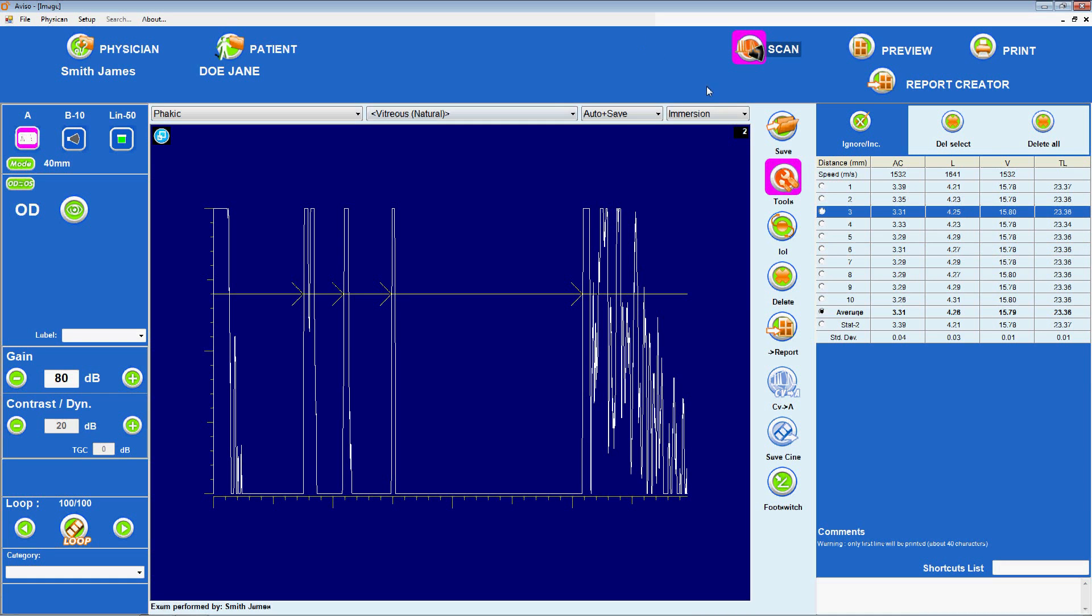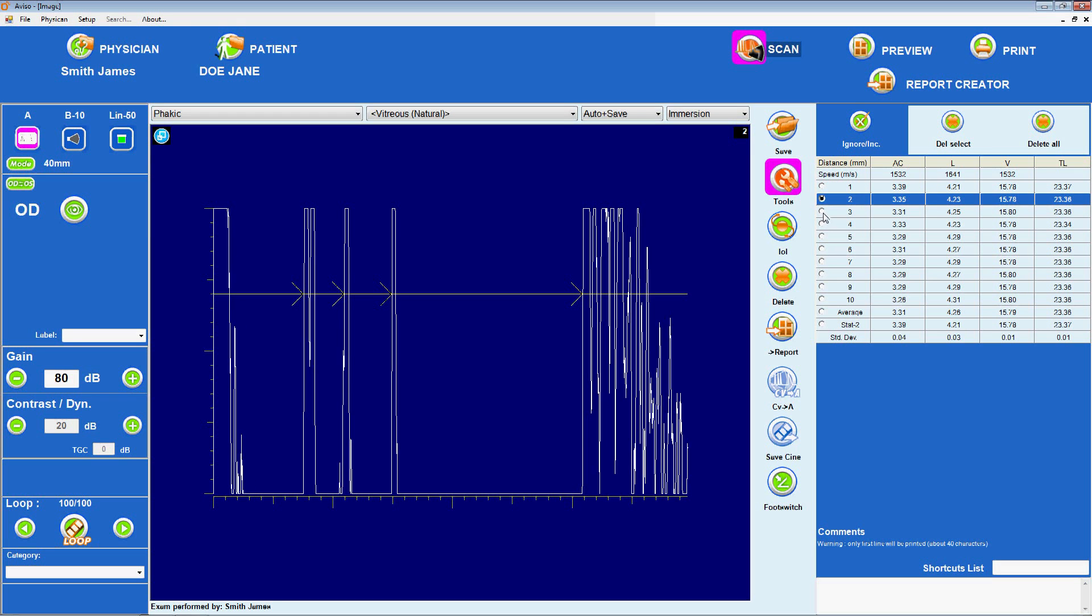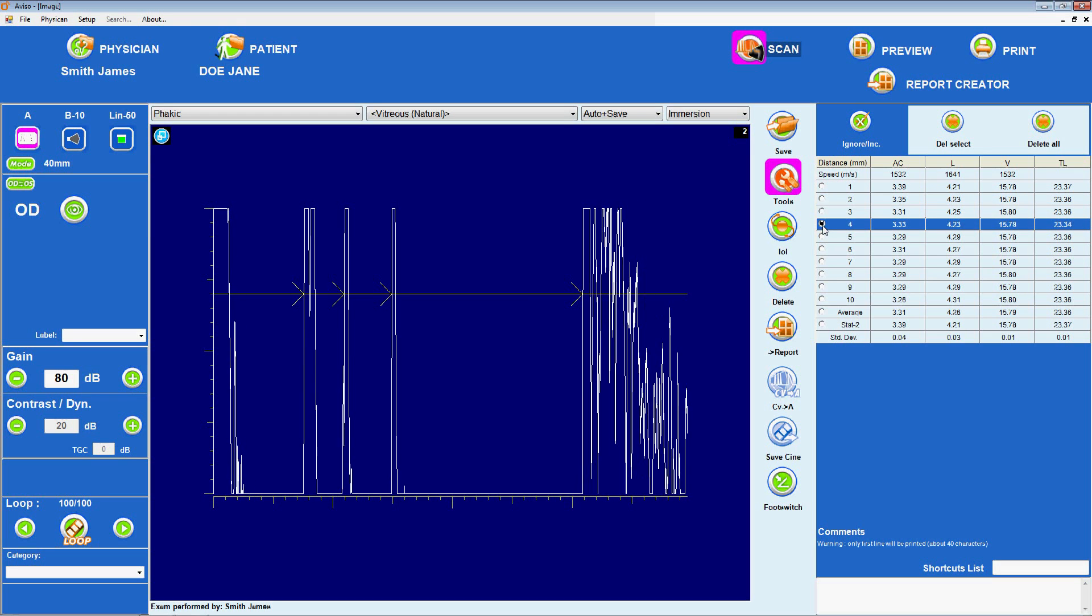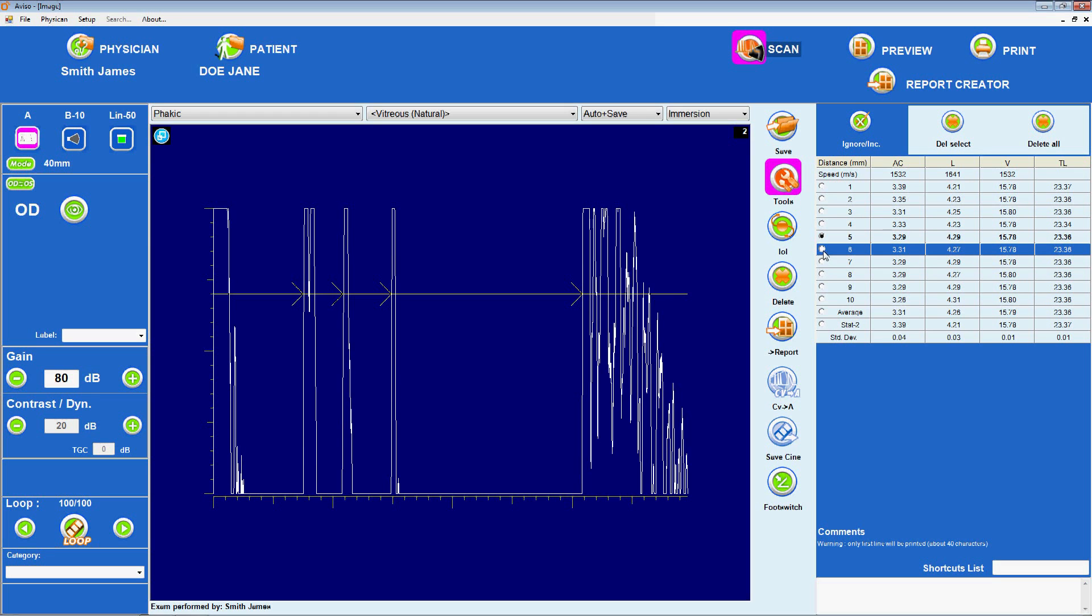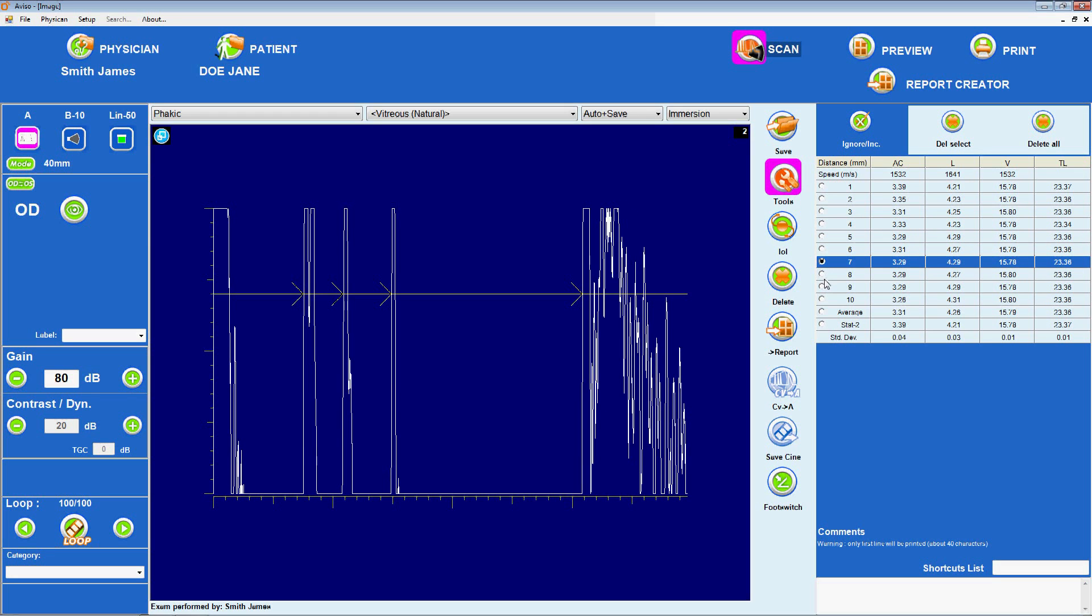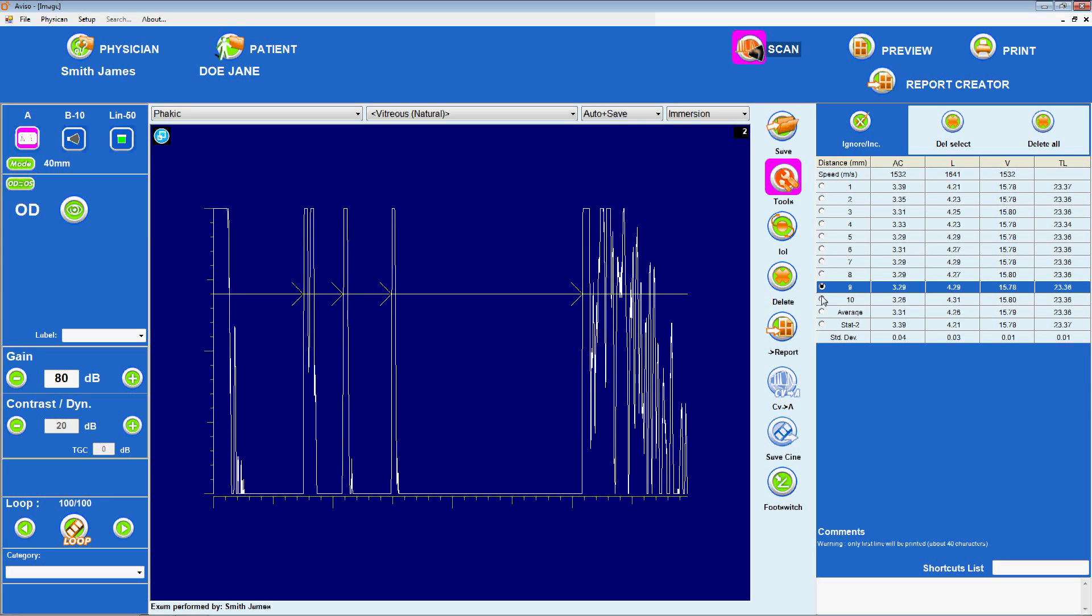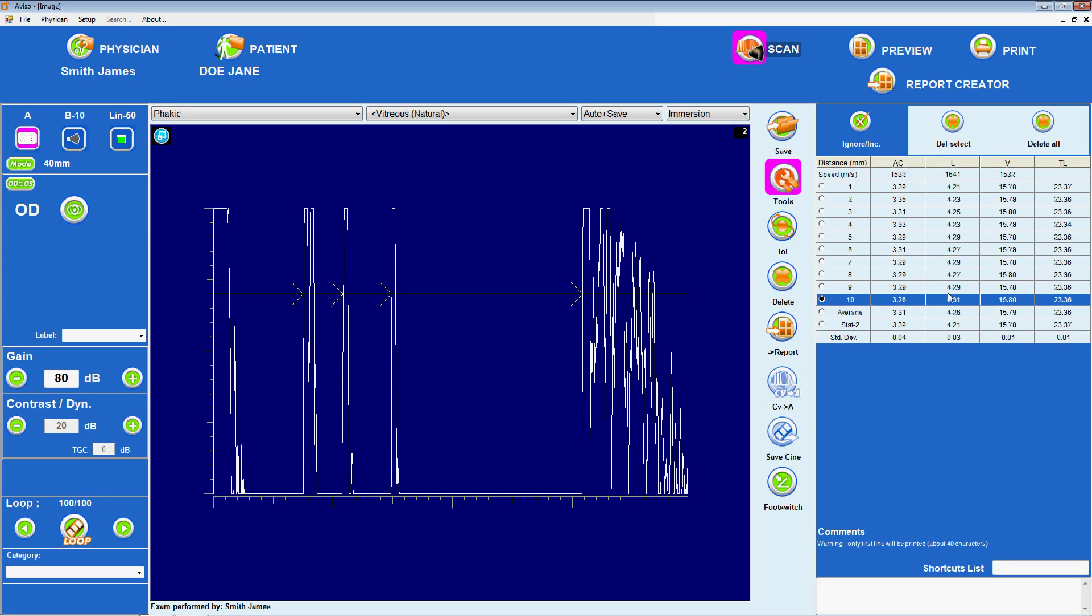A good scan also includes the deepest anterior chamber measurement. When using the contact method, the deepest anterior chamber measurement is associated with the least corneal compression. Finally, the examiner should select the thickest lens measurement, because the lens is generally thickest in its center. Using the highest value for lens thickness helps to ensure that the ultrasound beam was directed nearest to the center of the lens.